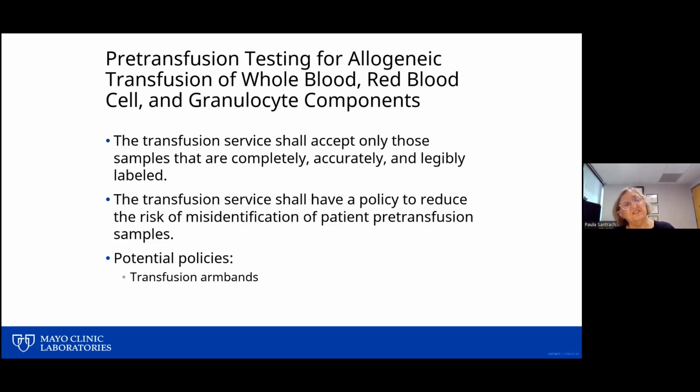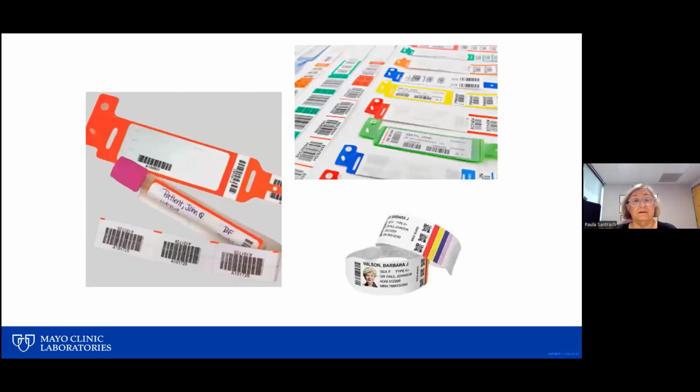So we have a different approach, which I'm going to illustrate for you, where we have a kind of closed loop system to generate samples for transfusion for phlebotomists. And we don't use a specific transfusion armband, but again, it's very commonly done.